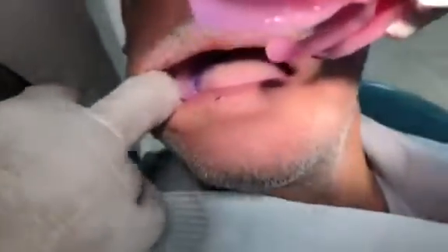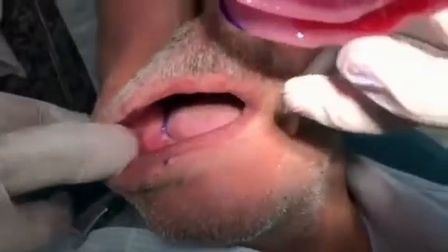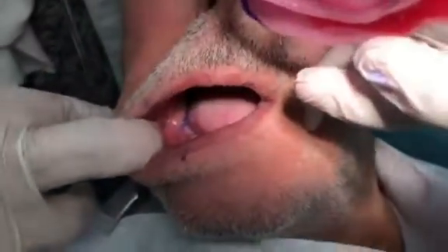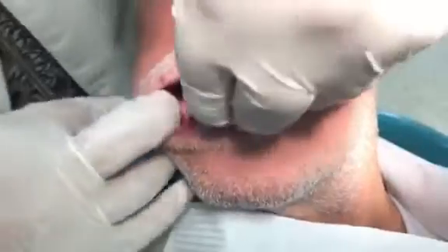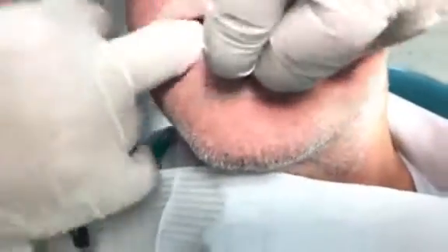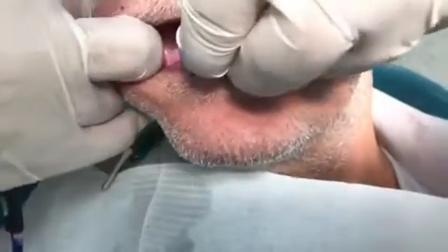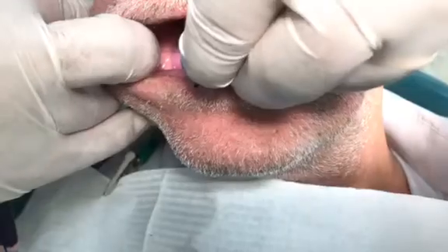Let's check this area. Look at the tissue without the tray in, then go in with the tray. I would say this is correct — it's better than the other side.